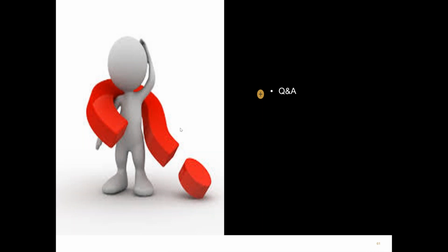Can one just use the VPRO and not do the MOPs? 100%, Terry. The only time I personally would do both is if I had an incredibly difficult case, let's say we were rotating a tooth 70 degrees, something crazy that you or I might try just to do it. If we got it all the way, that would be great. In that case, I might consider doing MOPs and then introducing a VPRO too, but no, I would do one or the other. And once again, most of the patients are preferring to do just the VPRO.